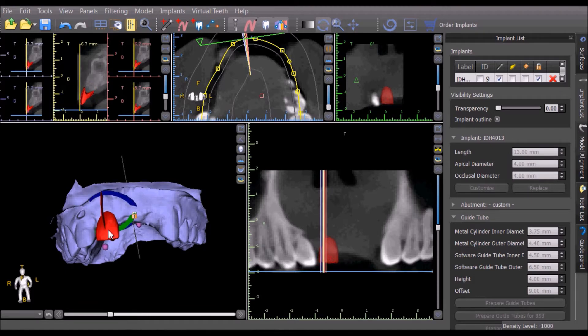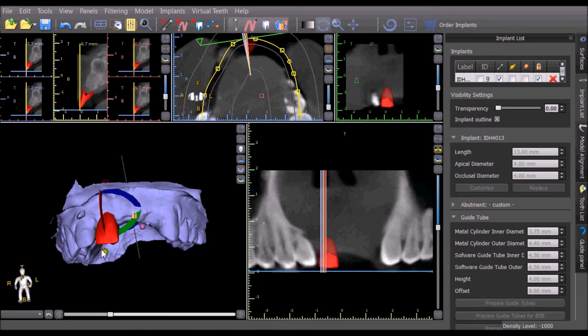The size of the tooth can be adjusted in the 3D view by grabbing the purple dots and dragging them to increase the length or the width of the virtual tooth.